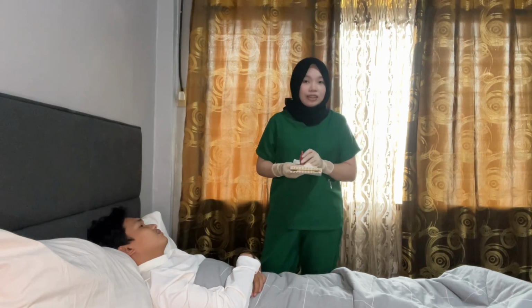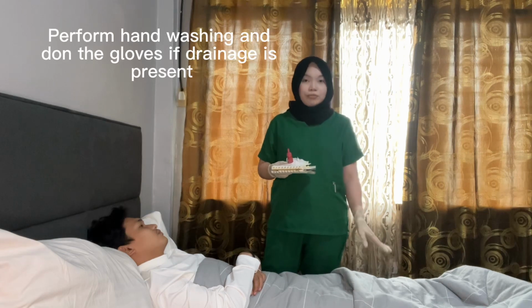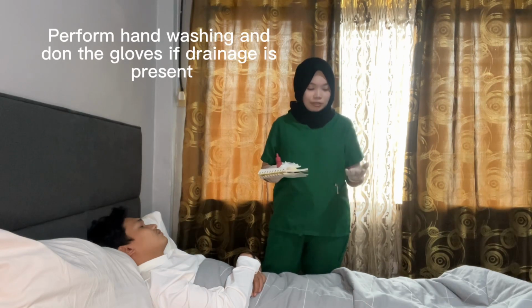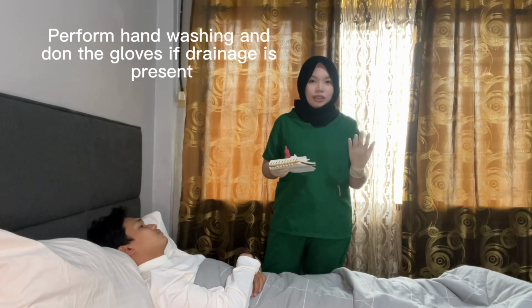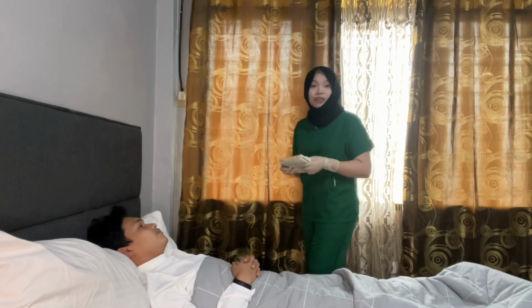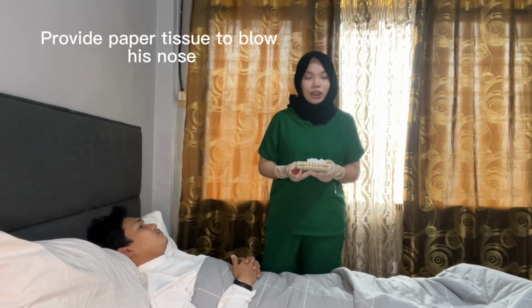After that, bring the medication to the client's bedside, then perform hand hygiene and don the gloves. So let's assume that we already did the hand washing and donning the gloves. Next is to provide the patient with a paper tissue to blow his or her nose.